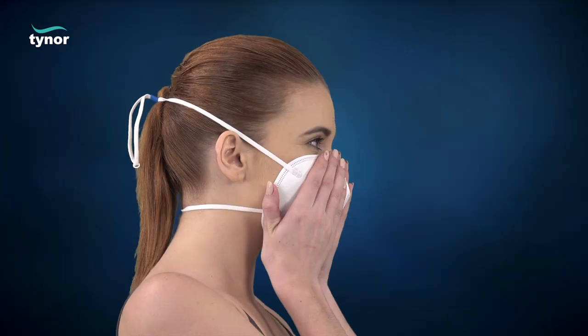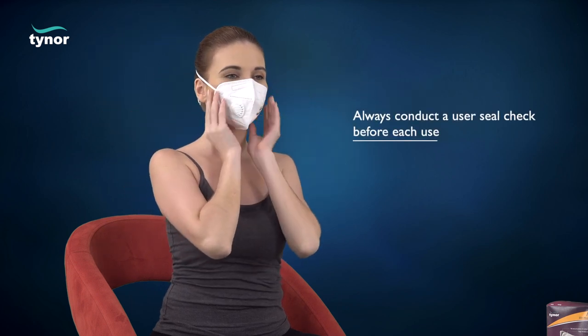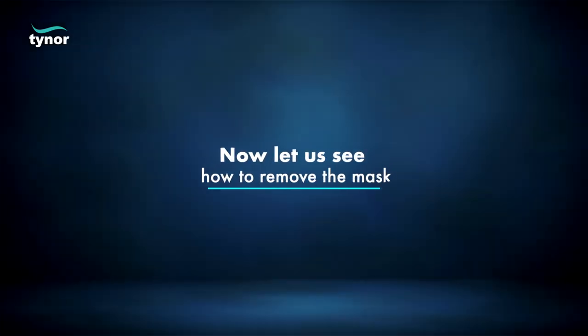Be careful not to disturb the position of the respirator. If air leaks around the nose, readjust the nose clip as described in step 5. If air leaks at the respirator edges, adjust the head straps for correction. Always conduct a user seal check before each use. If you cannot achieve a proper seal, do not use the product.